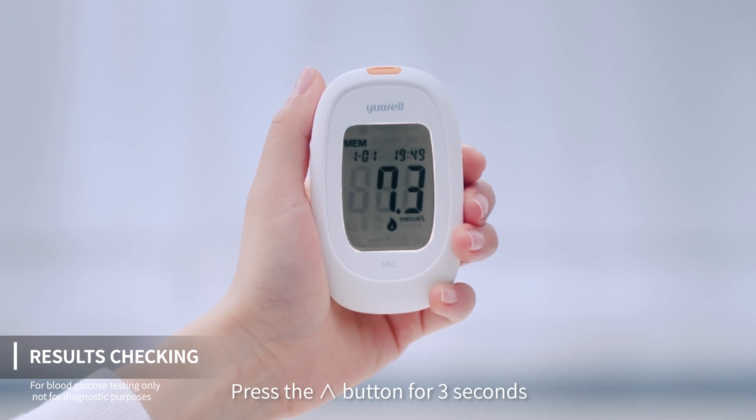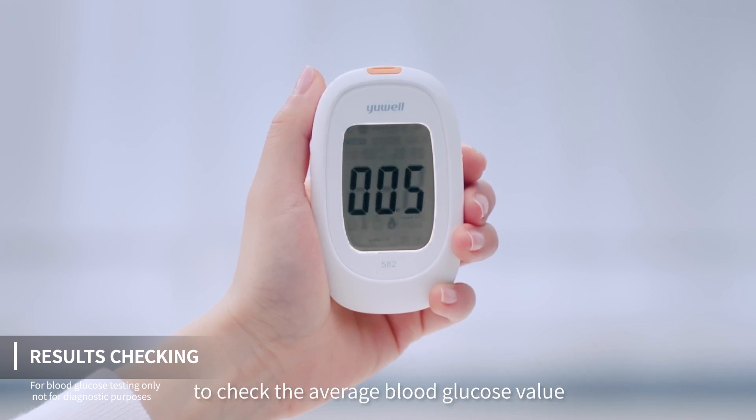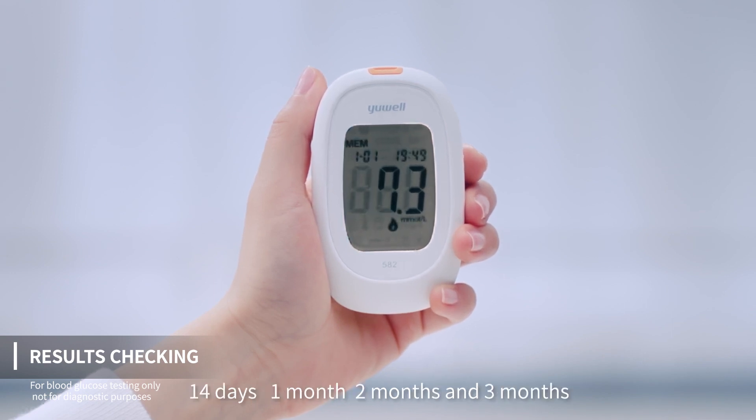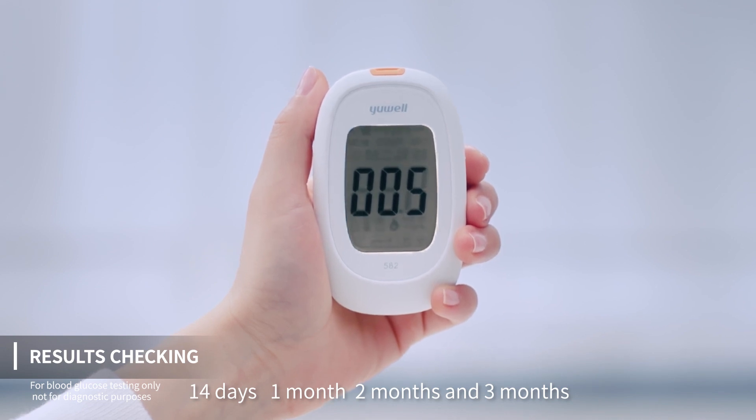Press the up arrow button for 3 seconds to check the average blood glucose value before or after meal for 7 days, 14 days, 1 month, 2 months, and 3 months.